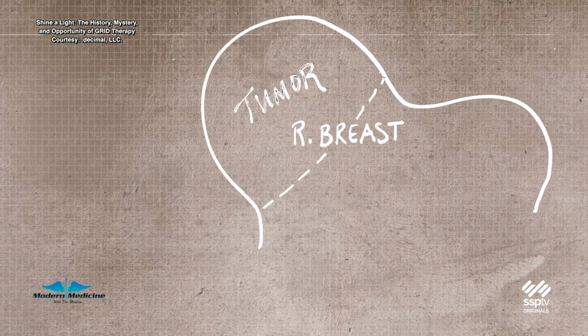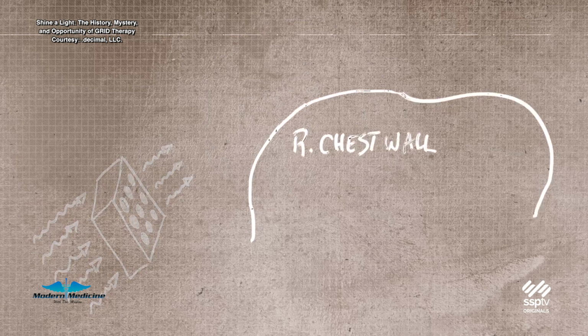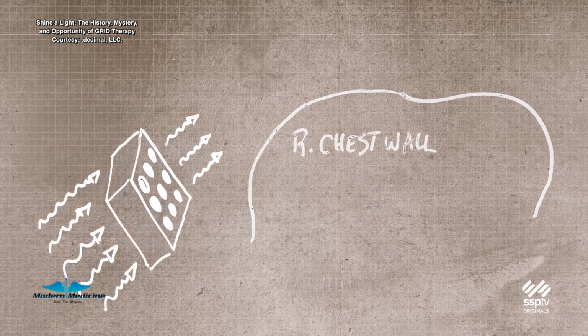Now, it's worth a pause to review here. This was a case of an enormous tumor, treated with the grid followed by a conventional course of radiation. The treatment was an astounding success. Not only did the tumor disappear, but the patient didn't even need post-radiation surgery. In fact, an independent radiologist read the post-treatment medical images and assumed surgery had actually been performed. This relatively obscure grid treatment technique had effectively performed a successful surgery, not with a knife, but with light.